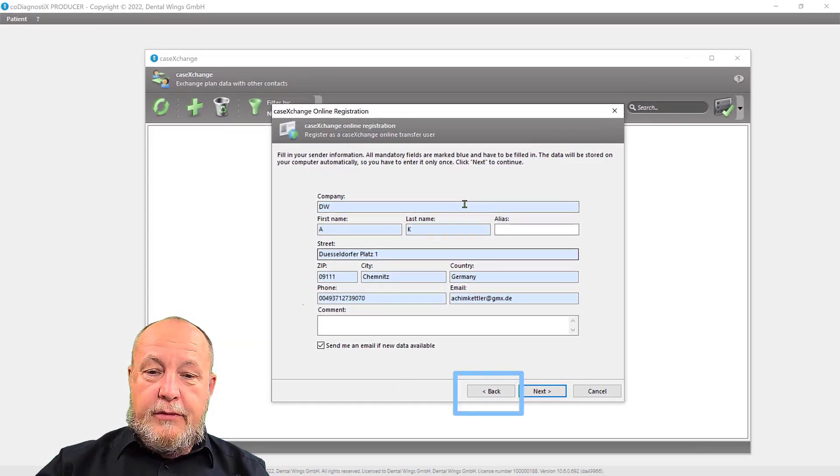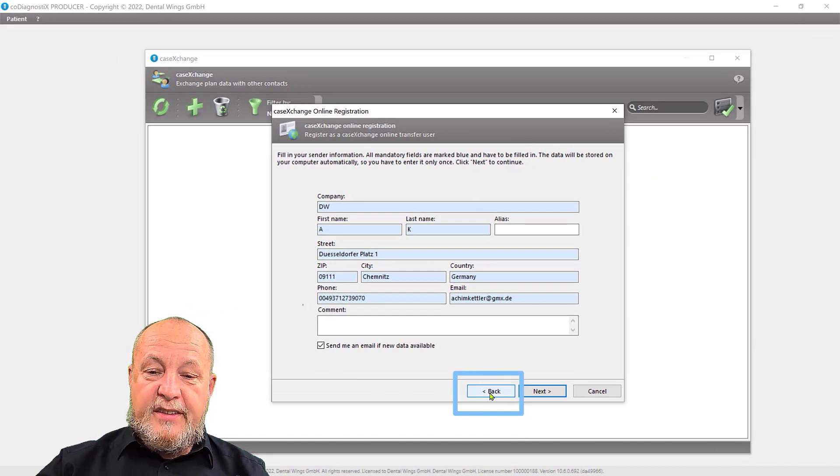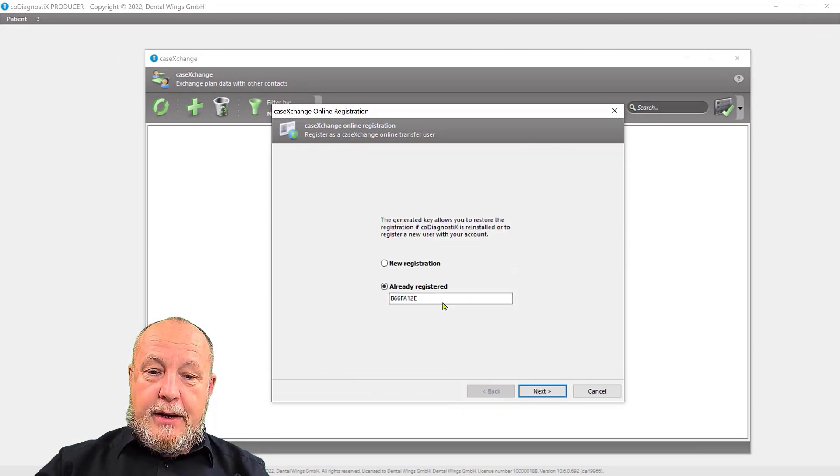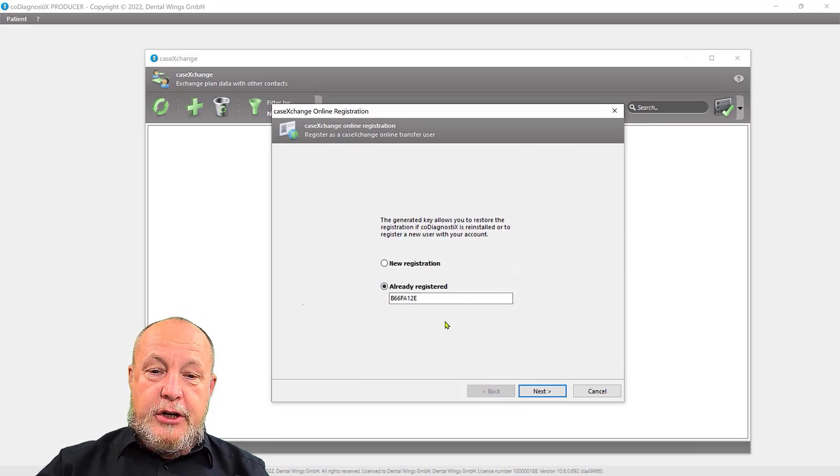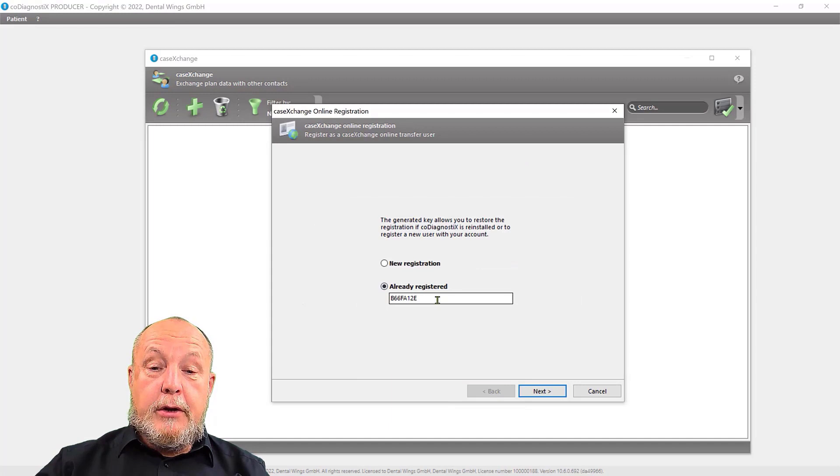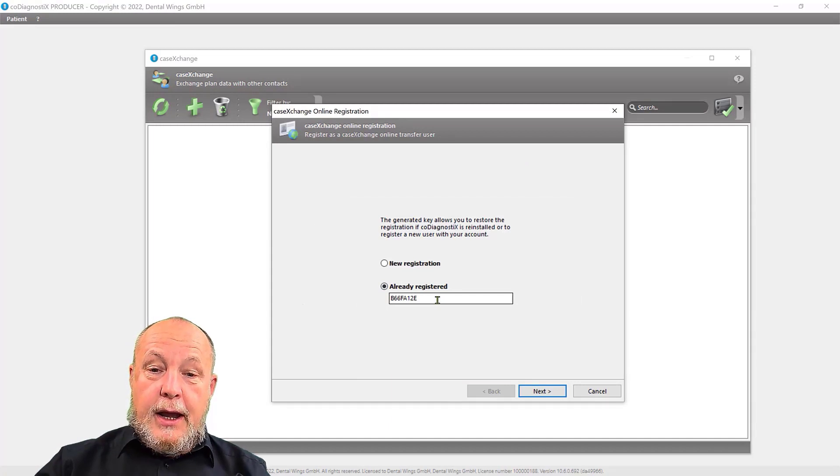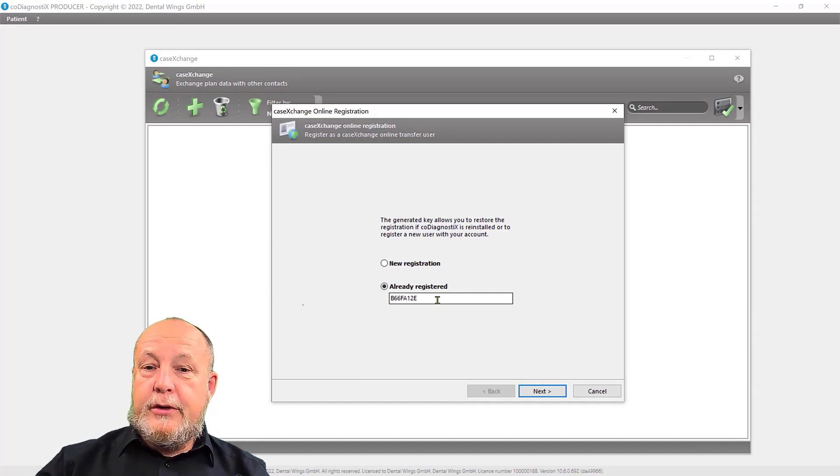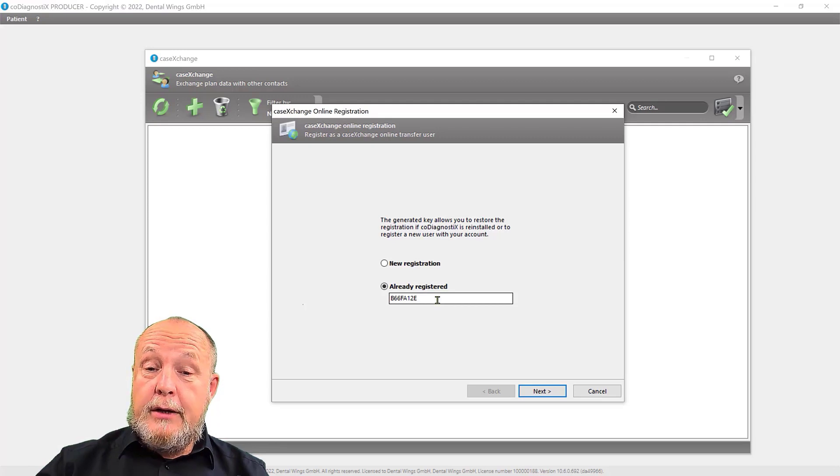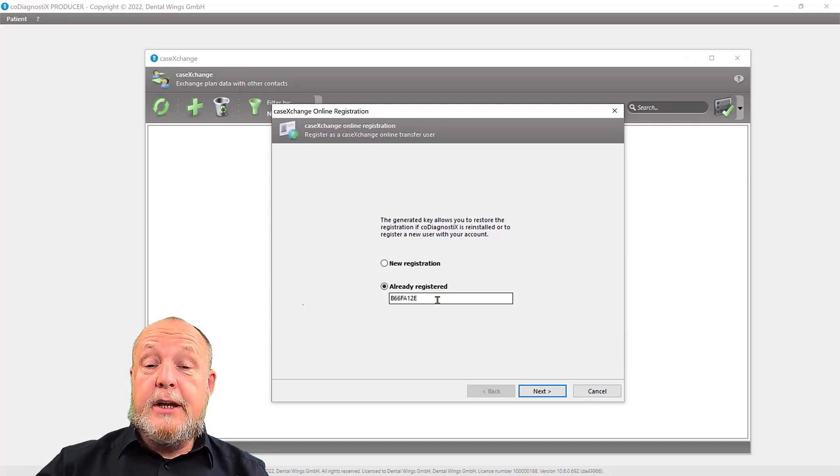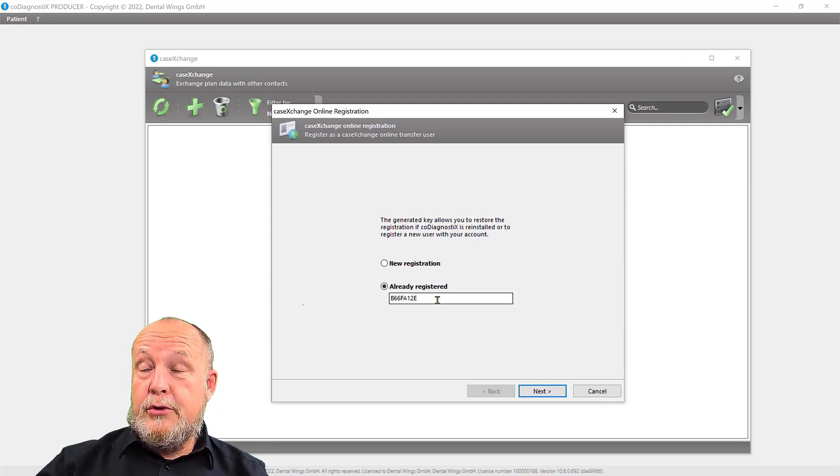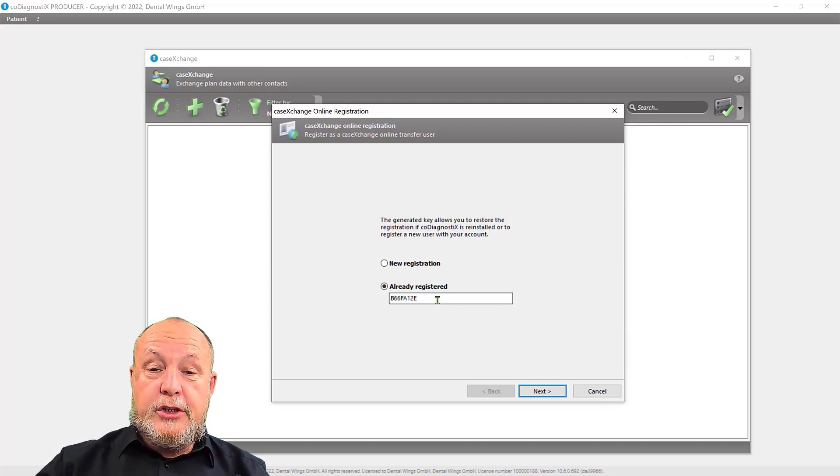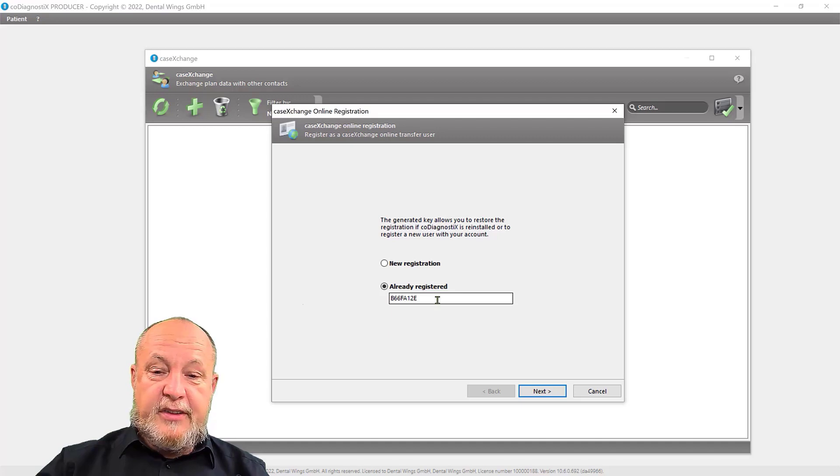And here you have the possibility to go one step back. And here you find your registration code, you can copy it, write it down and insert it already registered in your new CODiagnostics installation on the new computer, and all your connections will be there.